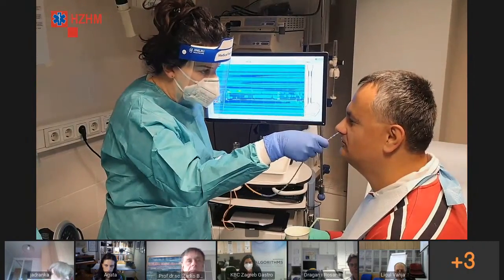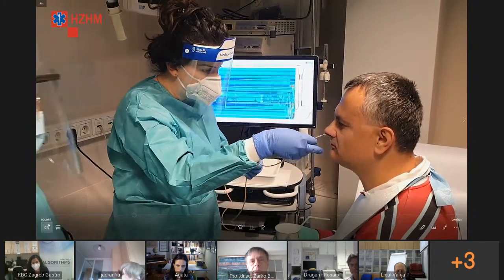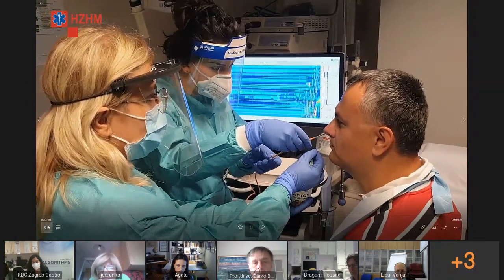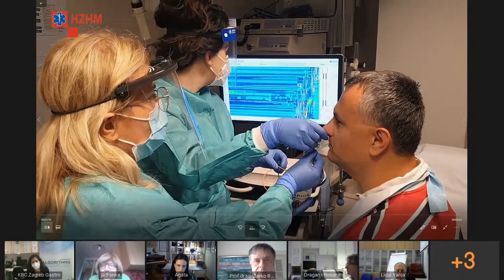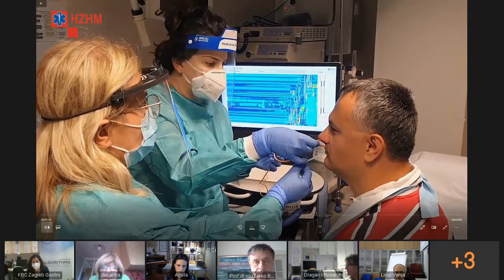Jesmo li dobro? Samo mirno. Progutate lagano. Uzmite čašu bliže ustima. Opustite ramena i radite sitne, male gutljajčiće. Još jedan, bravo, još polagano, ne morate više, udahnite i izdahnite.